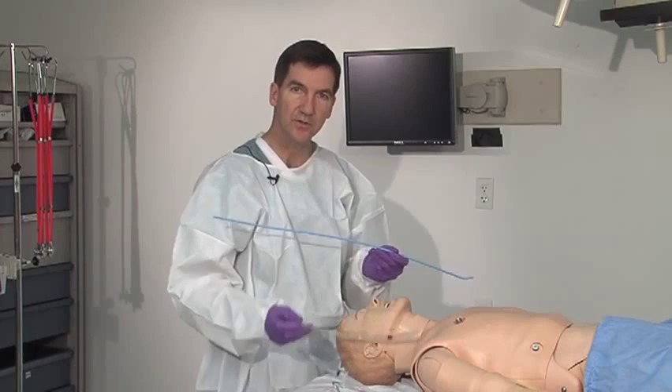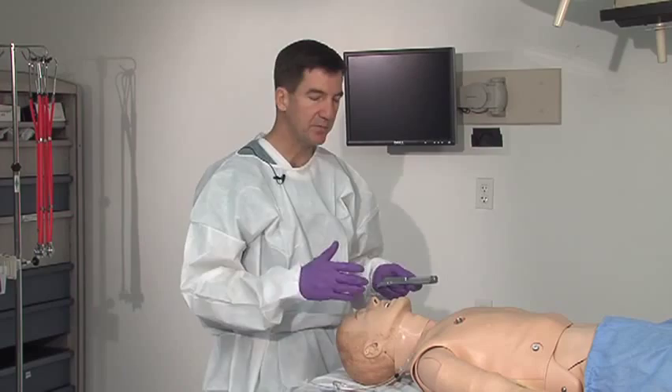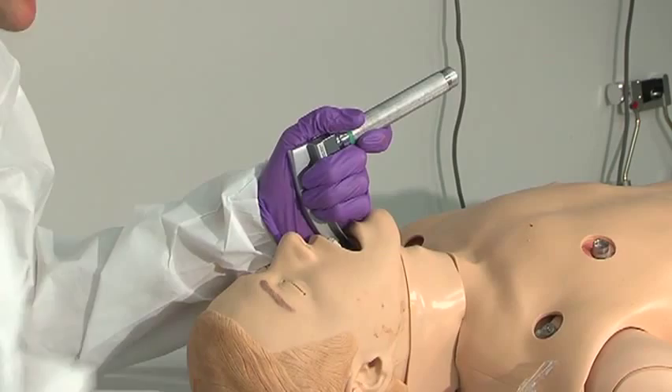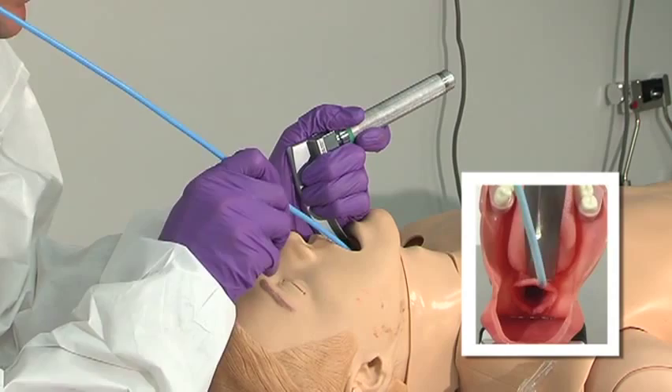Once it's in place, then you simply slide your ET tube over. You follow your same endotracheal guidelines, making sure your equipment is ready, suction is available. Sweep the tongue to the side, visualize the cords as best as possible, and then slide your bougie just past.